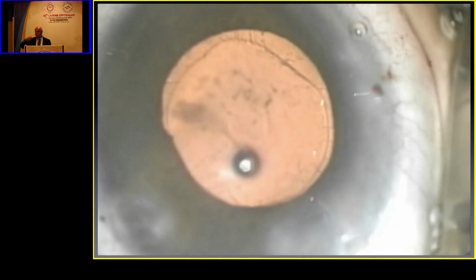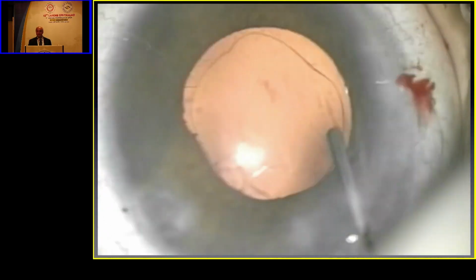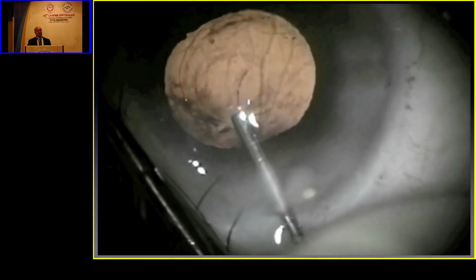First, the posterior capsule is not as weak as we think. You can hold it, you can vacuum clean it. If you don't pull, it will never tear. And you can wash the cells, but if they don't wash away, what should you do?